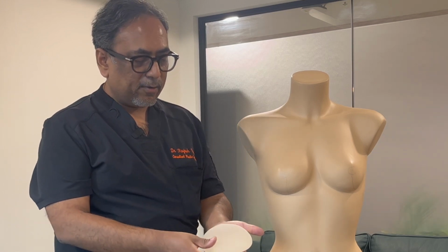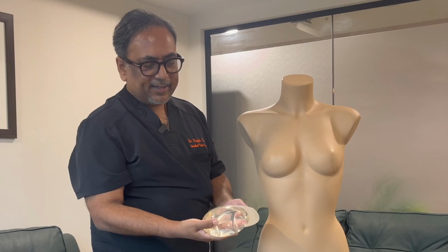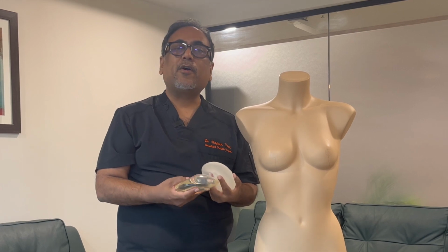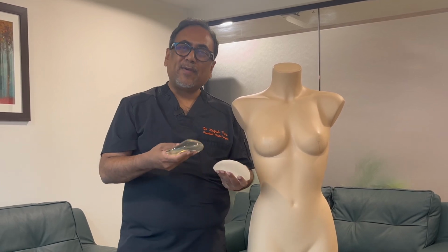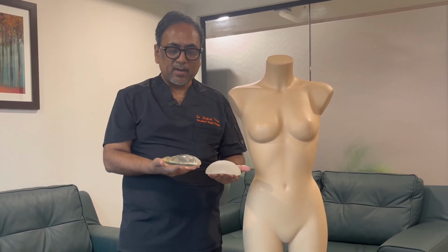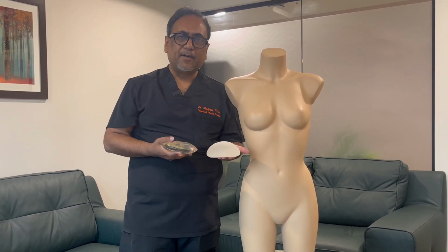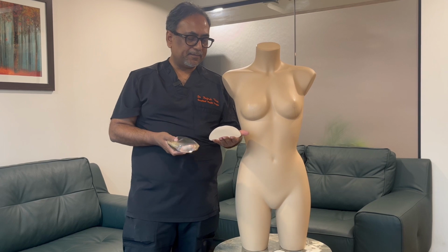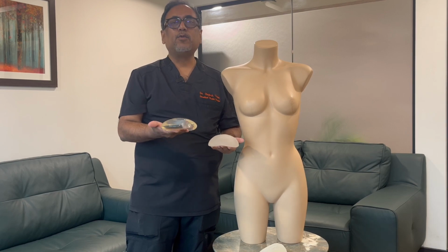You can see this is a round implant, and it is textured. So you have textured implants as well as smooth implants. Now it has been proven that the association of anaplastic large cell lymphoma, although the incidence is very rare, is negligible or even nil by using smooth implants. So we would use a silicone round smooth implant like this, and textured implants have some amount of association with breast implant associated anaplastic large cell lymphoma. So textured implants are getting out of vogue for the simple reason that the chances, whatever little there is, are very less with smooth implants.